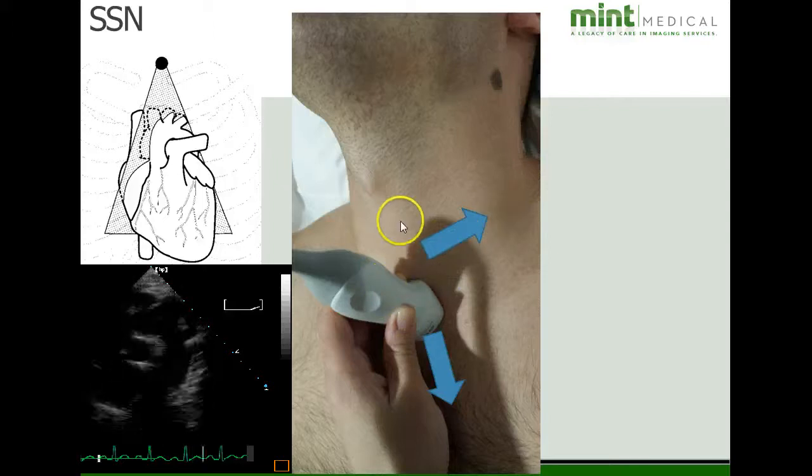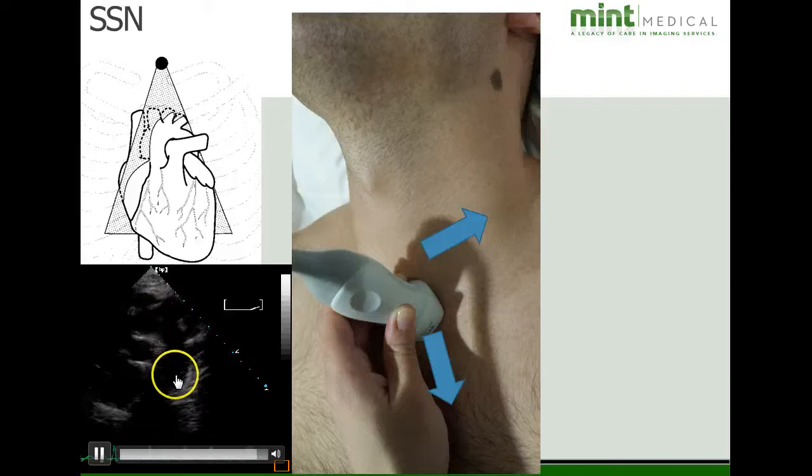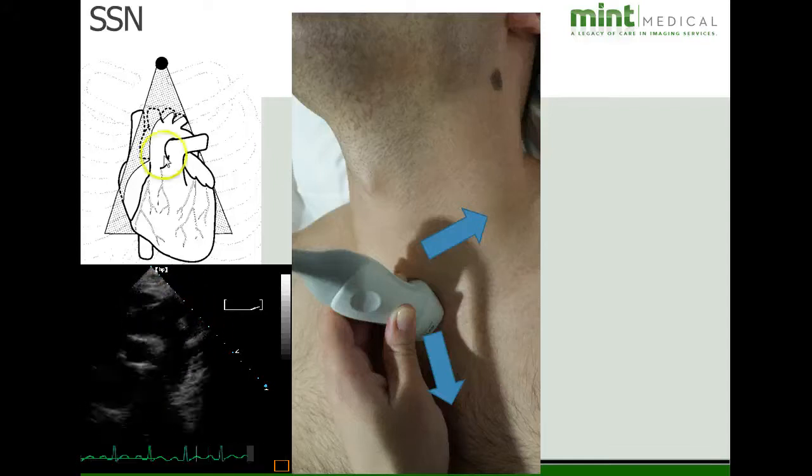So just over the person's left shoulder at 1 o'clock. And once again, the transducer should be angling down into the body. Important to be down, the angle down the transducer. You need to tip this transducer upward and look down into the body. So obviously you want to have the person flex their head backwards. And once again you'll see a portion of the ascending aorta, transverse, and descending aorta. And you'll have a cross section of the right pulmonary artery here. This is the brachiocephalic, left common carotid, and left subclavian. The 3 branch vessels coming off, as you see, 1, 2, 3.